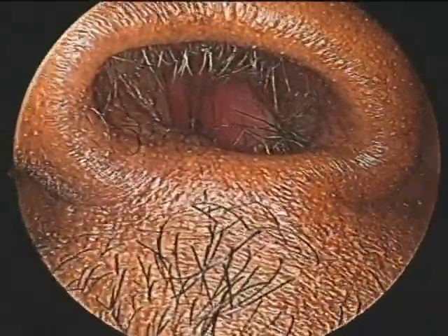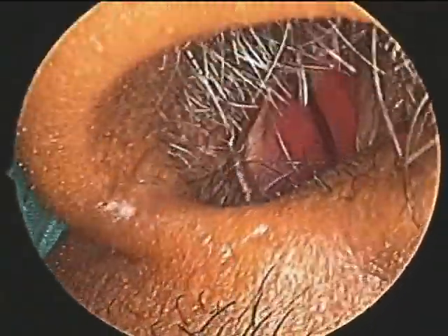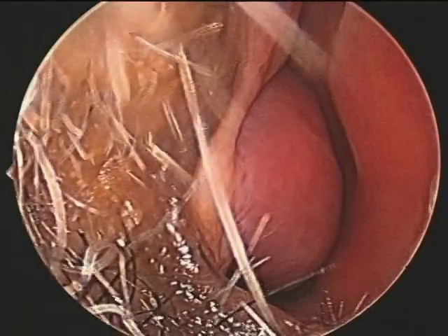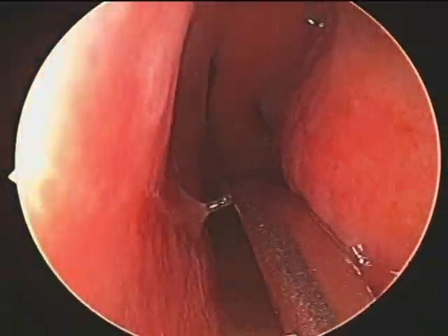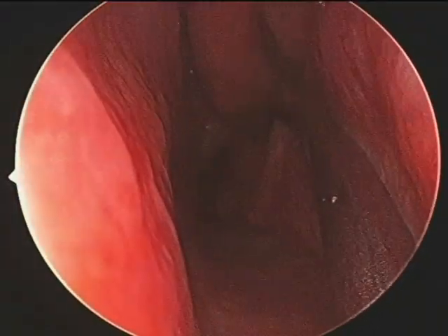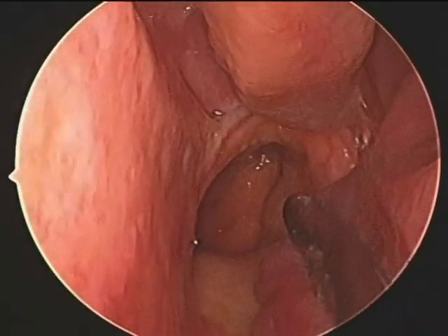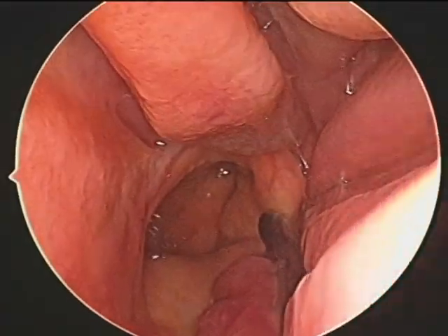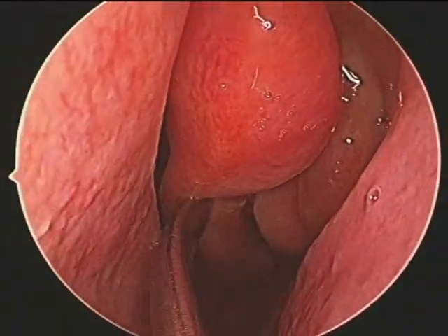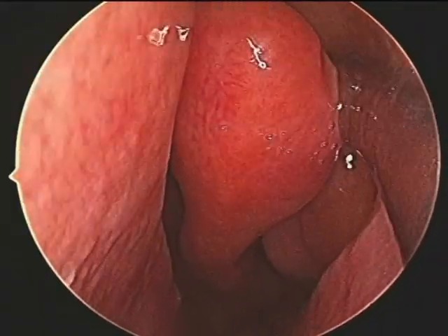This is an intraoperative view of the left nasal cavity. You can see engorgement of the inferior turbinate on the left and then the right inferior turbinate, with hyperemia of the mucosa. We are now lateralizing the inferior turbinate and can see the nasopharynx, with some secretion at the Eustachian tube. The middle turbinate shows a small concha bullosa.